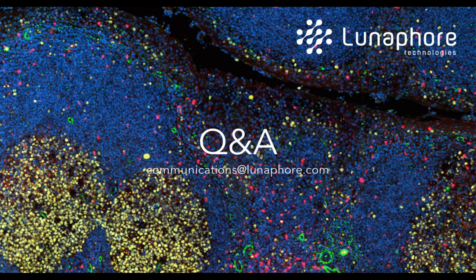Excellent. We have another question coming in. Someone is asking what resolution or zoom can you achieve with this device? Are details visible at the cellular level? Right. So we are going to reach under 0.5 micrometers in resolution.